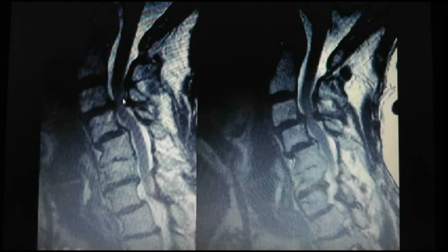It's ligamentum flavum, kind of obliquely cut. Whenever you see stuff like that on the sagittals, you eagerly go to the axials expecting to see some weird big thing there, and it's almost never there. If you think about it, the laminae are a triangle, at angles, so you're just catching it at the oblique angle, because there really isn't something bulging in posteriorly. You think that's artifact? Well, it's real.